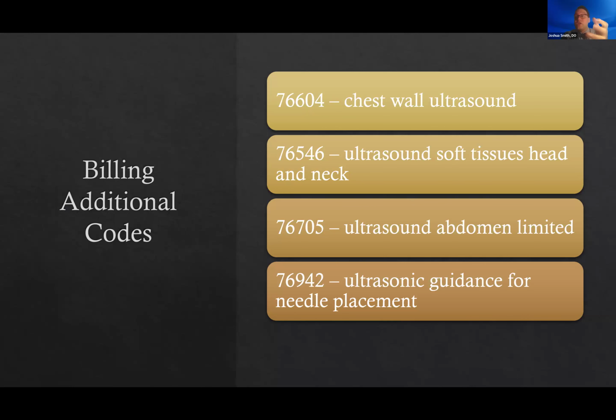But that's the time you might run into using that code, because you're going to find a lot of papers and a lot of things on adding ultrasound to assessments for neuromuscular respiratory weakness. Or, you've all had that patient come in for phrenic studies and you do them and it's really hard. Maybe because of the anatomy, your normative data for those amplitudes can be as low as 0.1 millivolts and still be normal, and you're like, man, I couldn't get it, but they have a barrel chest and already have trouble breathing and maybe some other comorbidities. I don't know if my NR is because I just didn't get the recording technically or because there's a big problem.